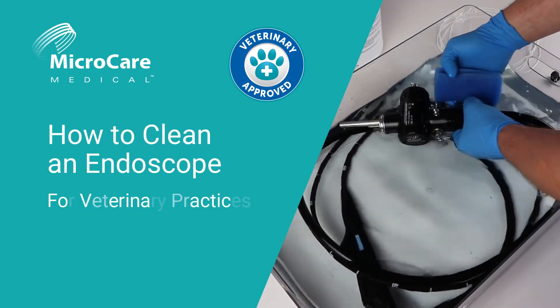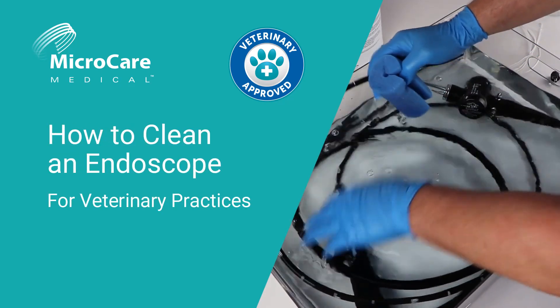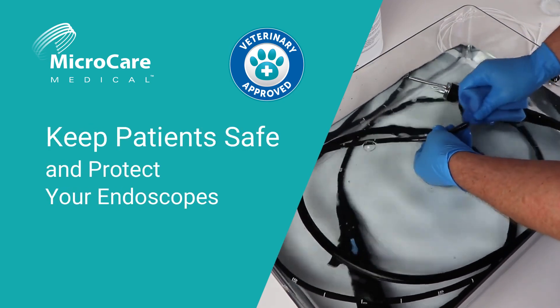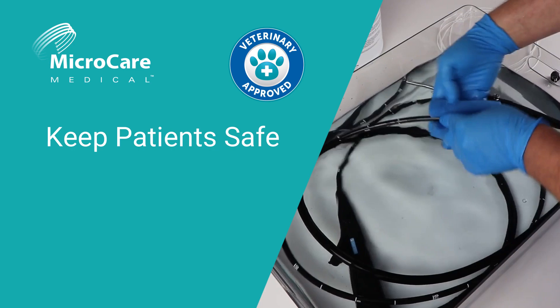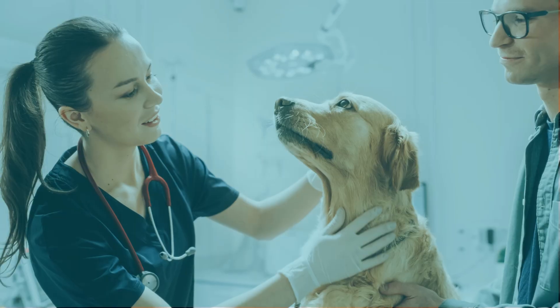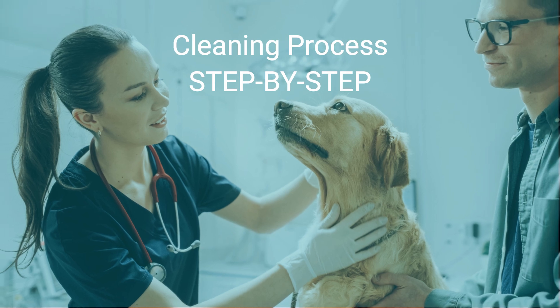Welcome to our guide on cleaning endoscopes for veterinary practices. Proper cleaning keeps your patients safe and ensures your endoscopes last longer. It's important to clean the endoscope before disinfecting or sterilizing. We'll take you through the cleaning process step by step.